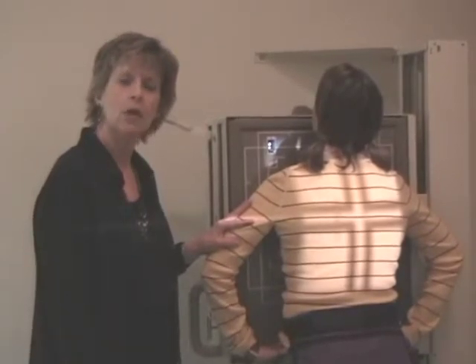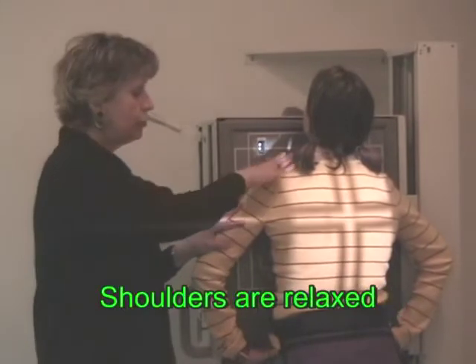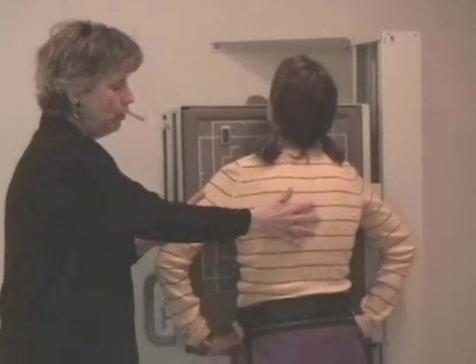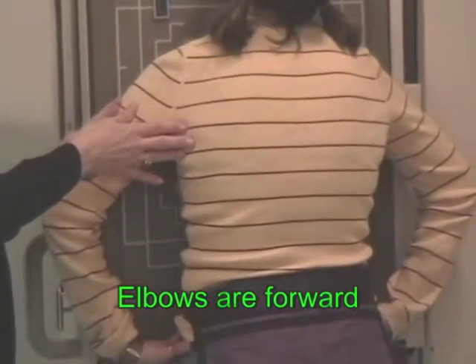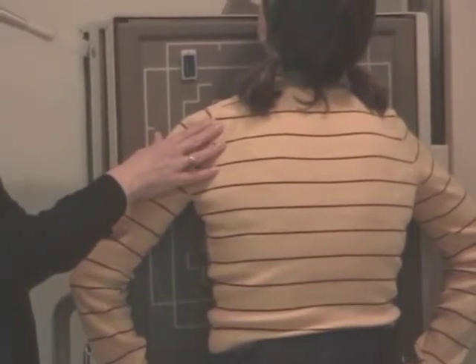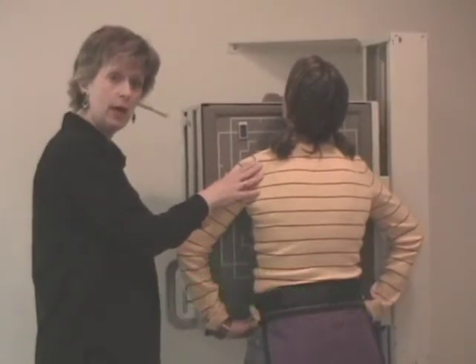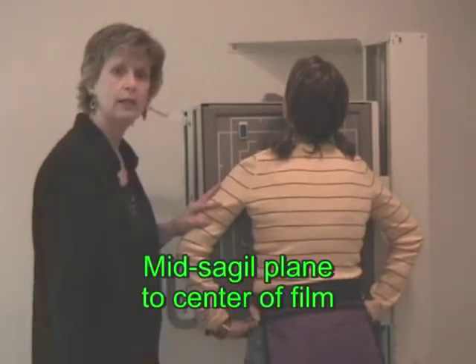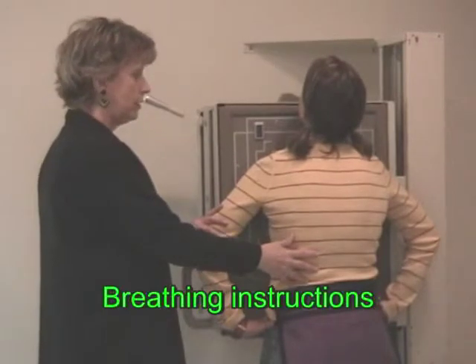Okay, so let me recap. Her feet are spread for stability. Her shoulders are relaxed to bring the clavicles down from the apices. Her elbows are forward to bring the scapula out of the lung field. And she's facing the board straight on. That's the PC information, positioning criteria. Centering was film's edge is 2 inches above the shoulder with the mid-sagittal plane to the center of the film. Now I need to give her some breathing instructions.